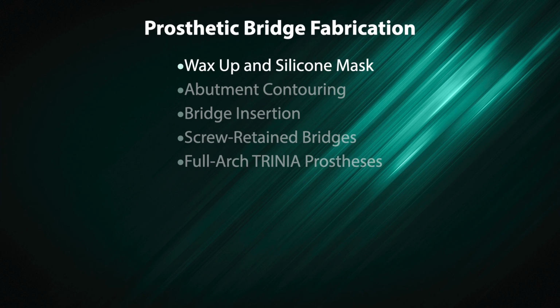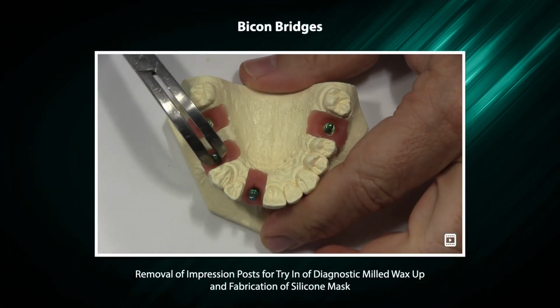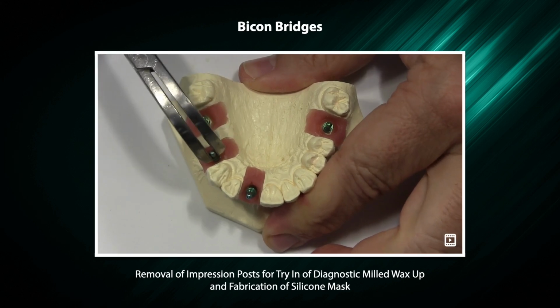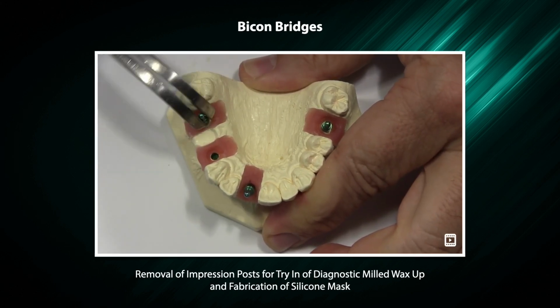Wax up and silicone mask. Removal of impression posts for try-in of diagnostic milled wax up and fabrication of silicone mask.